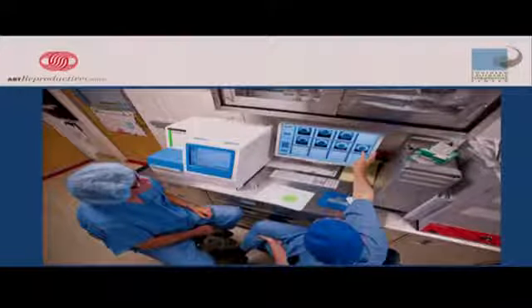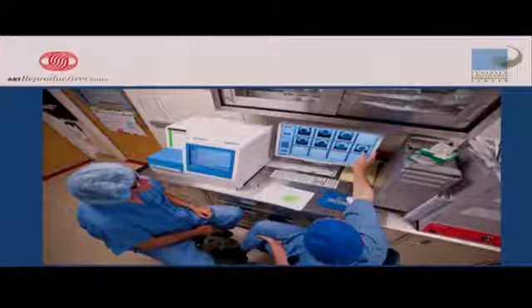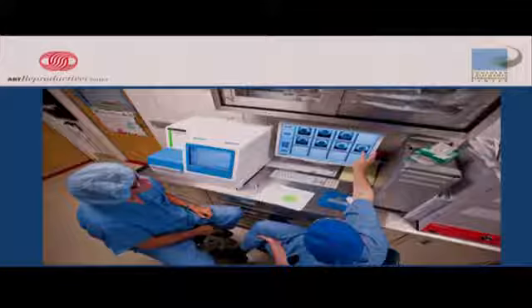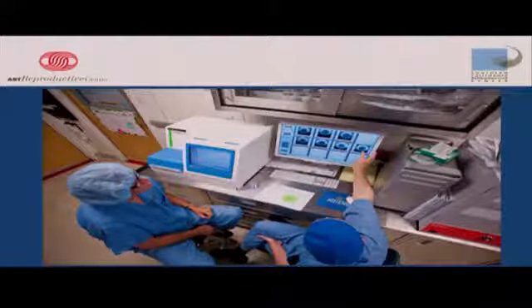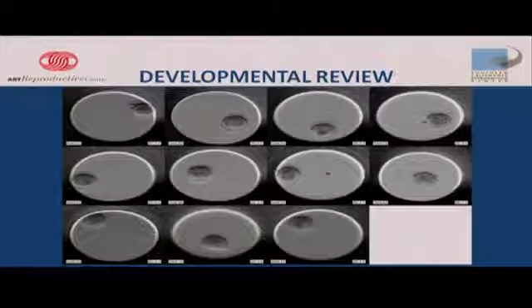So here actually is the EmbryoScope on the left-hand side, and Dr. Hill, who's my direct boss, and I'm on the right-hand side, and we're going through a set of, in that case, 7 embryos on that screen, looking at them all through their entire developmental history and trying to pick what are the top 1, then number 2, then number 3 to make the best decision for the physicians. And then we track it. We actually print up a picture from it, and we send it off to the physician and the patient so that they can have the appropriate discussion about what has happened. We tell them all about different reasons that we suggest one versus another. And then ultimately, if they become pregnant, we go ahead and give them a video. So we do a lot of review of every embryo's development.